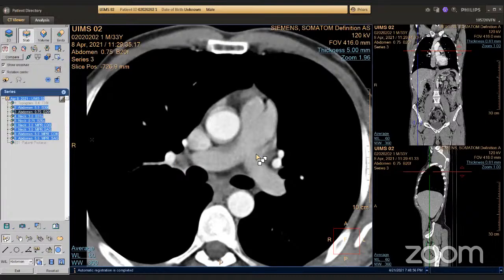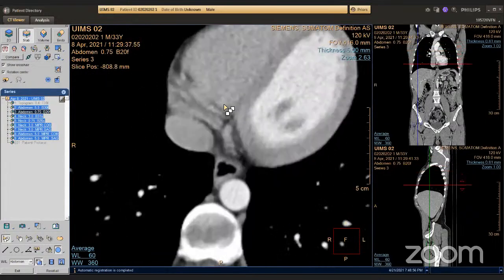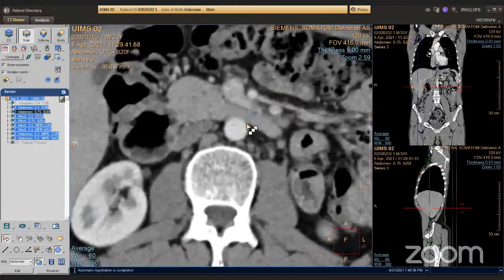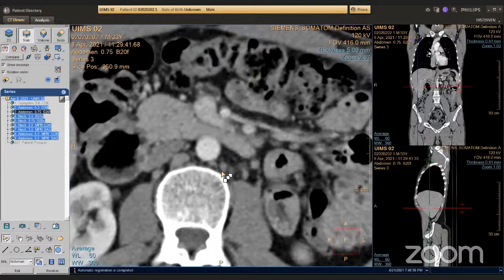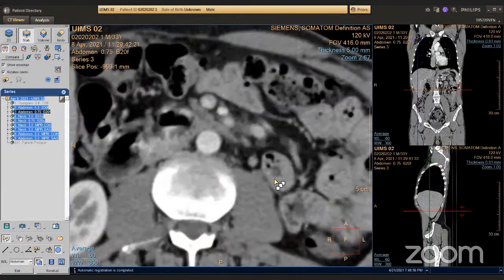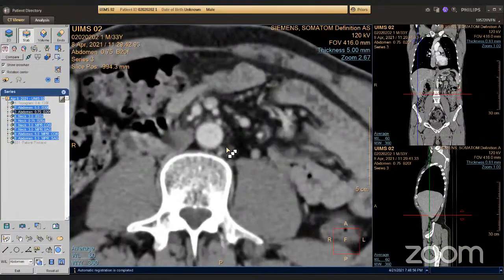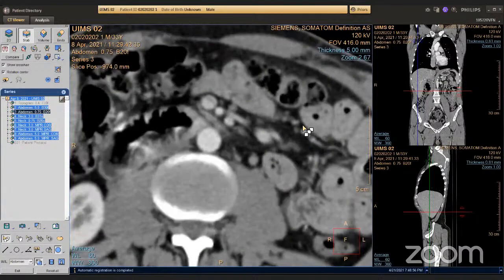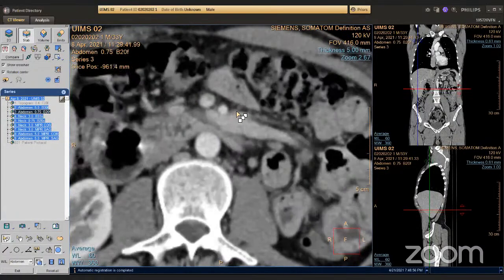And in the lung hilum, and this is actually quite hard sometimes to grasp, the mediastinal lymph nodes. In the abdomen, you have lymph nodes around the aorta. So if you check the retroperitoneum like that, you can see that this is a lymph node. Okay, that's a lymph node. There are these small things. Some of that is also neural plexuses, but some of it are lymph nodes.